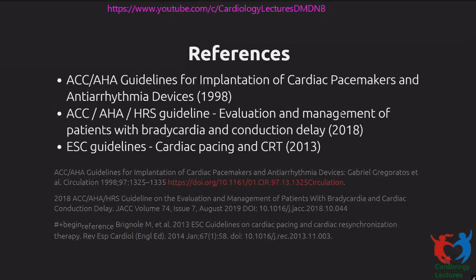The setting you have described is that they initially got a VVI pacemaker for whatever reason, and mostly what happens with this is either they are unchanged or they worsen. When they come with symptoms, definitely you have to consider upgrading them to physiologic pacing. So definitely consider putting in an atrial lead and a His bundle lead, or an atrial lead and an LV lead, and changing them over to CRT.